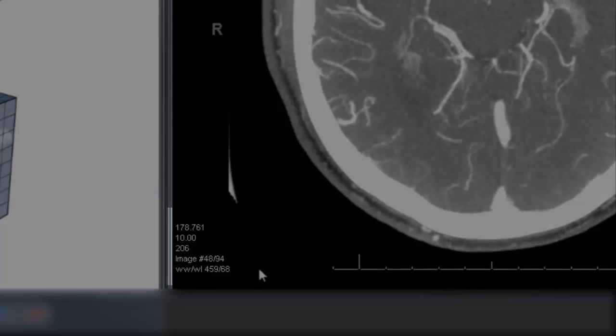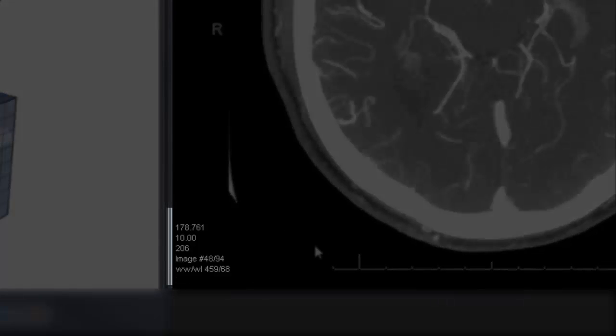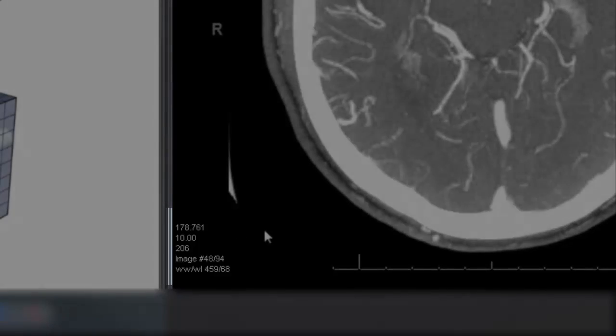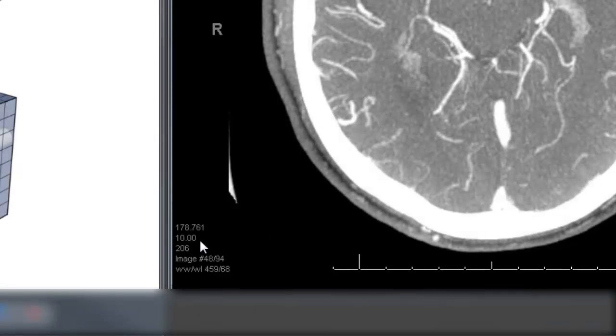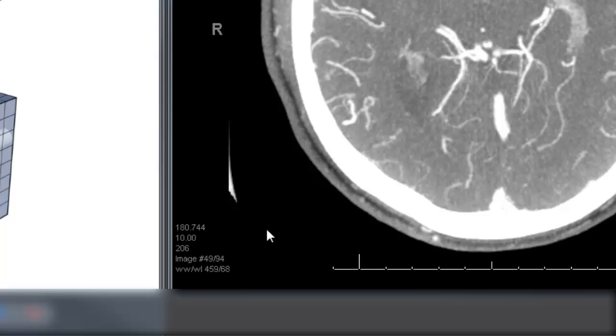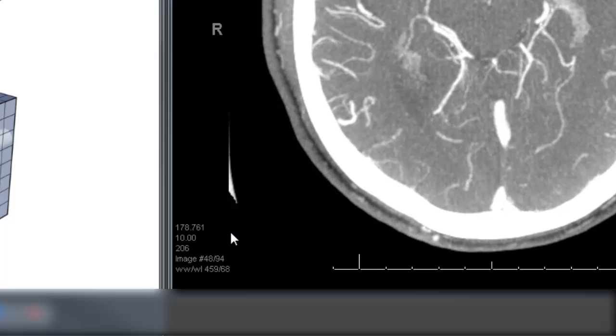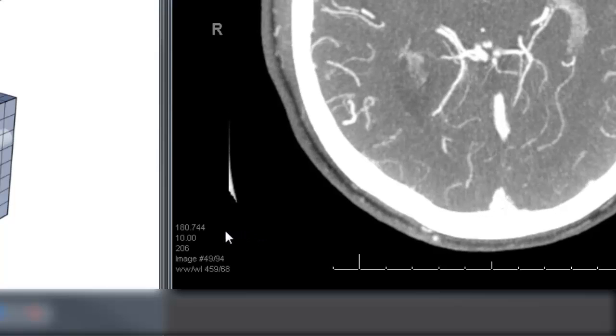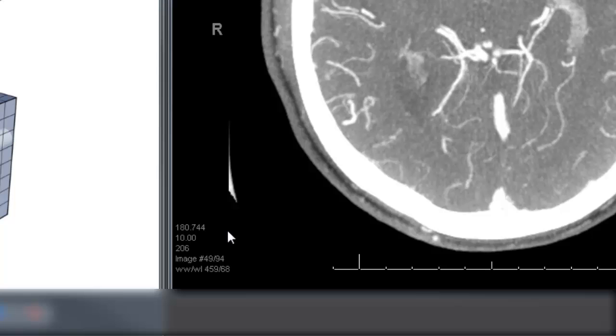Here it's presented with a 10 millimeter slice thickness. Here it doesn't tell you that that's the slice thickness but you can see as you're scrolling that number doesn't change, the number above it does and that's the actual current slice center position.